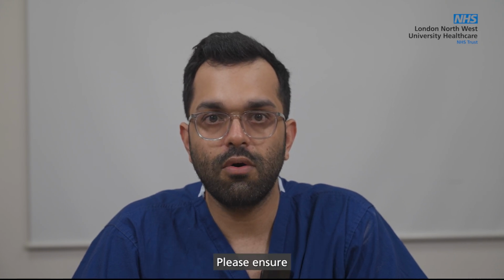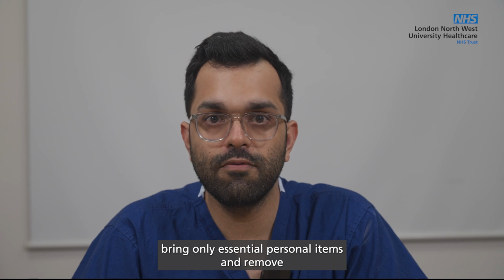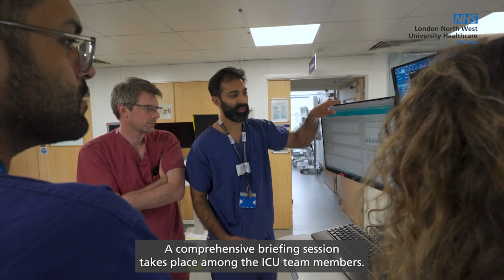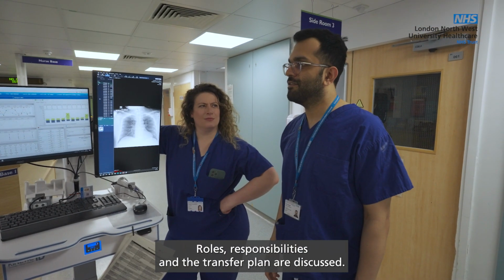Please ensure all staff members accompanying the patient to the MRI scanning room bring only essential personal items and remove all jewelry prior to the scan. A comprehensive briefing session takes place among the ICU team members. Roles, responsibilities, and the transfer plan are discussed.